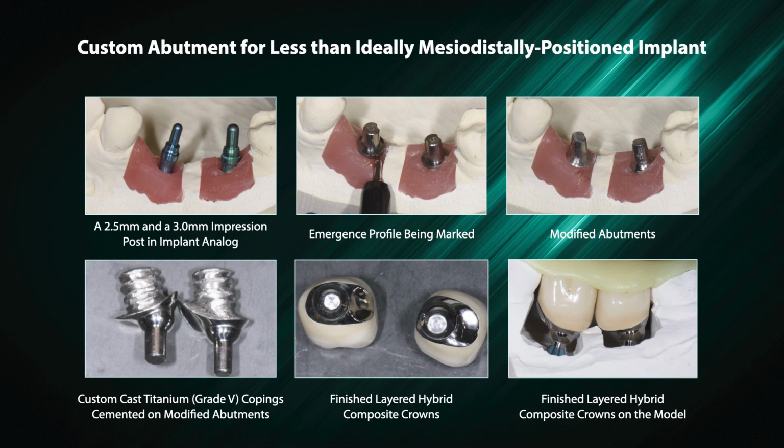The bottom left image is of custom cast titanium grade 5 copings cemented on modified abutments. The bottom middle image is of the finished layered hybrid composite crowns. The final image shows the finished layered hybrid composite crowns on the model.